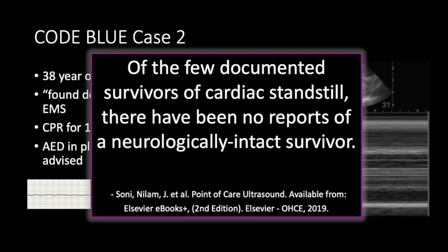So this could help us determine that in this case, this patient has probably sustained a terminal injury where resuscitative measures would not be clinically significant or meaningful, and it might be more compassionate or ethical for us to de-escalate and allow the patient to pass peacefully.